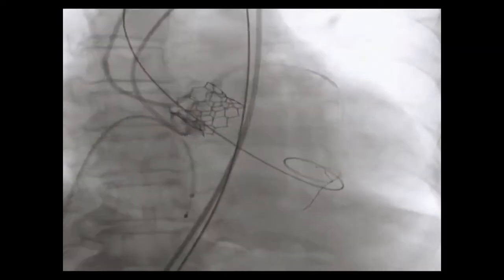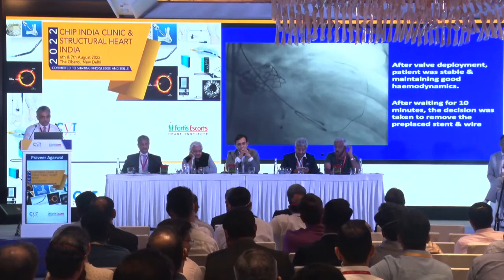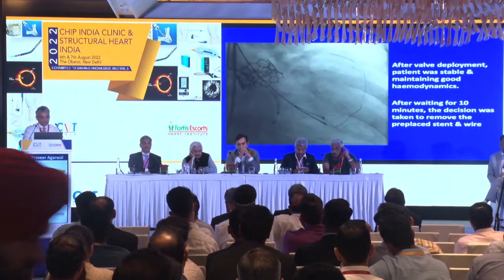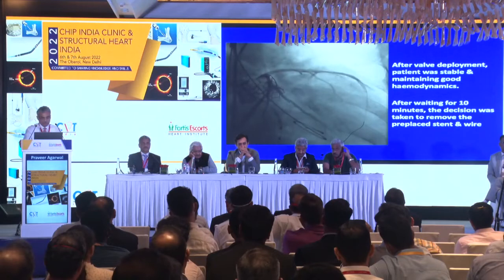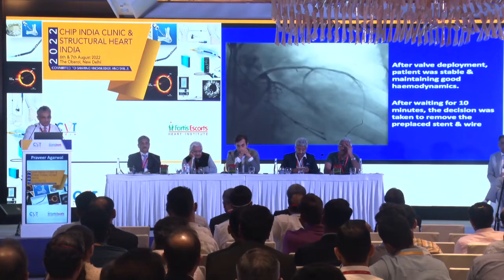Now see, these are the pictures taken. The patient was very stable, BP 140 systolic. And I could see something at the ostium of the left main, but we took a few more views. The people with me said, look, we wait for about 10, 15 minutes. If nothing happens, the patient is already very sick and we are done with the procedure. But I was still not very, very happy.